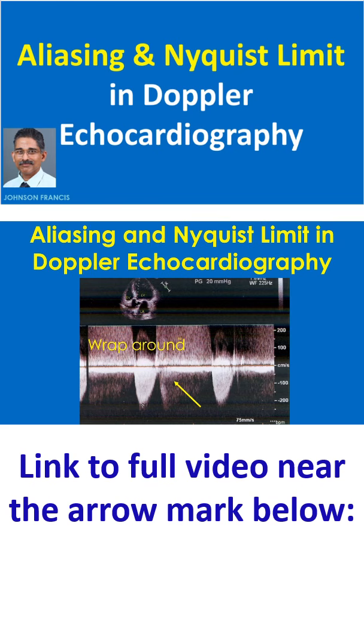Nyquist limit is half the pulse repetition frequency of the ultrasound signal emitted by the Doppler transducer. Aliasing does not occur in continuous wave Doppler as the transmission of Doppler beam is continuous and not in pulses.